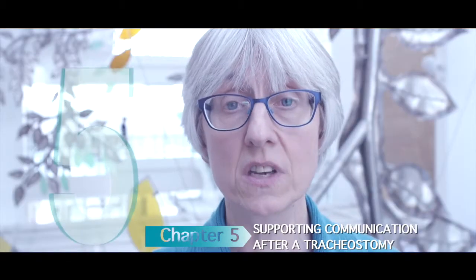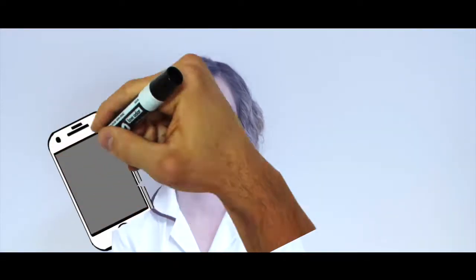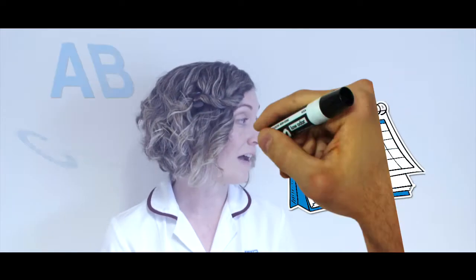Chapter 5: Supporting communication after a tracheostomy. The speech and language therapist will assess communication to establish the best way for the patient to communicate with their tracheostomy. This may be as simple as using pen and paper, or it could involve using an electronic communication aid. Here is a selection of communication aids that may be considered — here we have a whiteboard and pen, an alphabet chart or picture chart which can be personalised to share needs and wants, and the patient may wish to use a laptop to type their message.